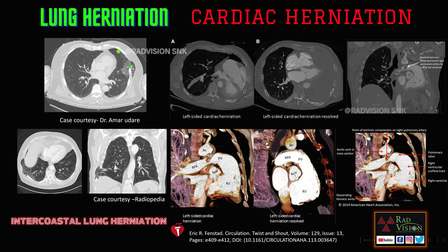Next, lung herniation — this was a case of previous trauma, and you can see lung tissue herniating through the intercostal defect between the ribs into the absent chest wall. Here is another case of intercostal lung herniation. Next, herniation of the heart — the complete heart is displaced to the left side; this was a case of left-sided pneumonectomy. After correction, the heart is in normal position. Whenever there is a pericardial defect, the heart can herniate through it to either side — this is called cardiac herniation.